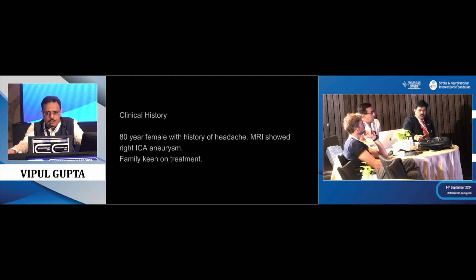We are trying to reconstruct. So in the first case I'm convinced, I would like to occlude that PICA. At best, the thrombus will do a PVO, right? Okay, all right. And reconstruction versus deconstruction, yes, I still offer all my cavernous aneurysms PVO, and I quote them less complication chance than a flow diverter. If there's a great ACOM with no venous delay, I think PVO is cheap, easy, local anesthesia, a 20 minute procedure. That's it, right?